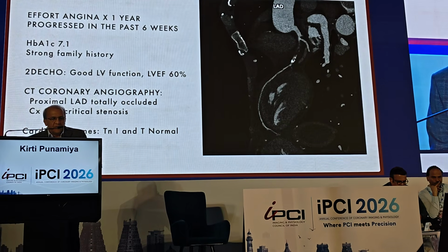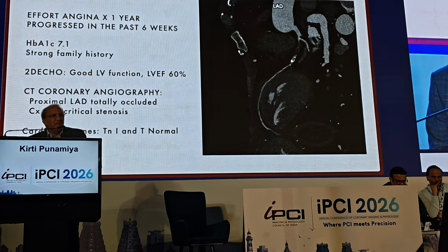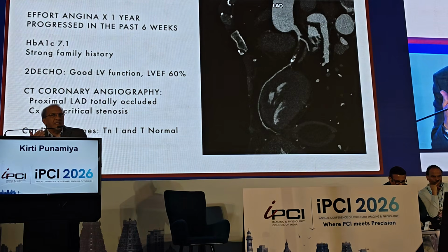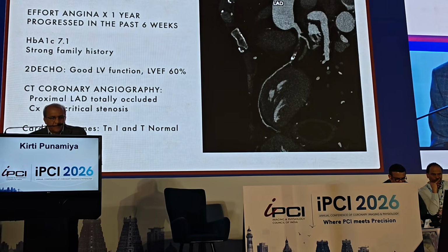lesion that we saw. Right after a right major diagonal, you can see a long segment of occlusion with varied intensities of tissue that you can see in terms of the fluoroscopy in the CT signals, ending up with a calcified distal plaque in that sense.